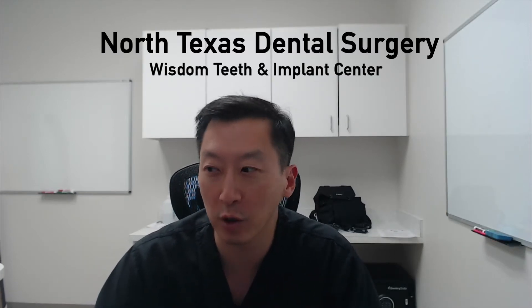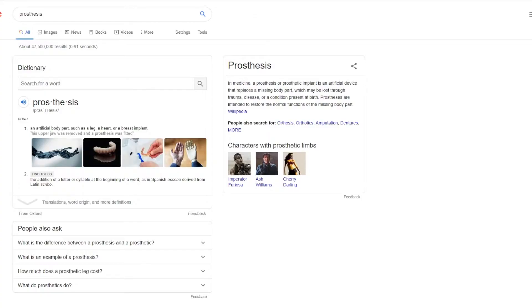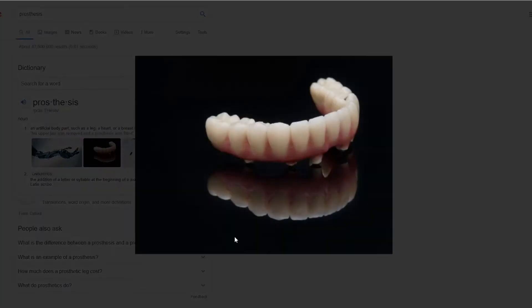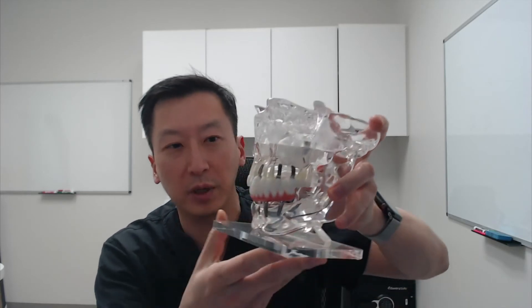I want to go online here real quick and show you what exactly is a prosthesis. A quick definition is an artificial body part, such as a leg, a heart, or a breast implant. What I love here is they have a photo of an actual prosthesis replicating your teeth and gums. This is for the lower jaw, and here on this model I have an all-on-four prosthesis for the lower.